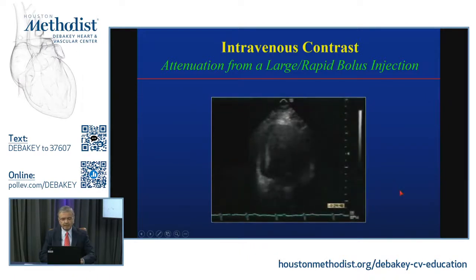how the contrast dissipates. It's now coming into the left ventricle, very nice, right? But watch, if that contrast was highly concentrated and a large bolus, you're going to start seeing attenuation that is less during systole. Why? Because you're ejecting quite a bit of this contrast. Now, I'm not seeing much behind it. Not that I'm not injecting enough. Actually, I'm injecting too much. It is highly concentrated, so all the contrast is reflected at this border. Why? Because the intensity and the concentration is much larger below.